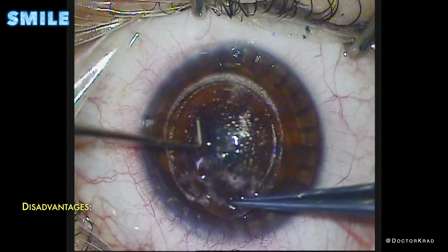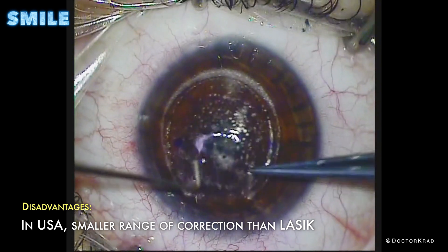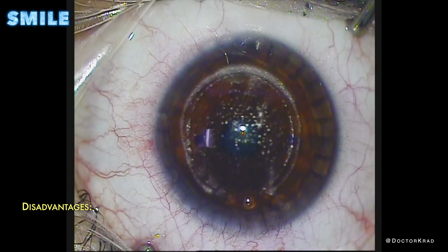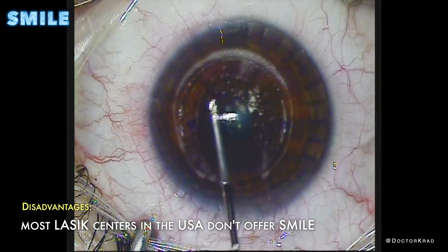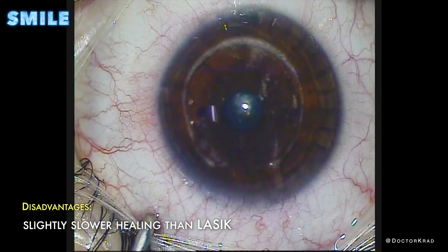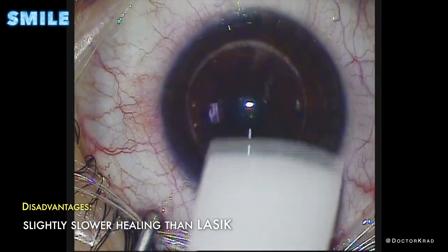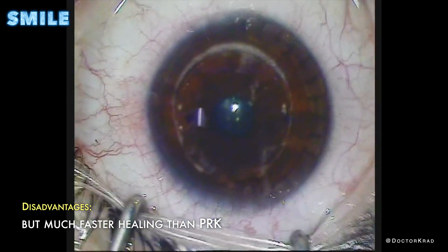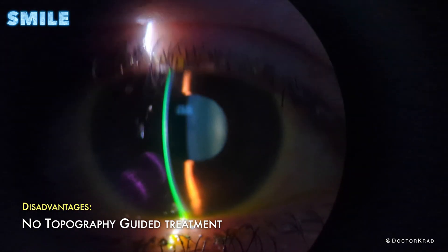The disadvantages of SMILE are the following. In the USA, we can't correct as wide a range of prescriptions when compared to LASIK, so fewer people are candidates. Most LASIK centers don't offer SMILE because it requires a very specific type of laser. There is a slightly slower recovery when compared to LASIK — the difference is usually small, a matter of days — where SMILE patients may notice a very slight steamy or foggy effect in their vision. There is also no topography-guided option at this point, unlike LASIK.